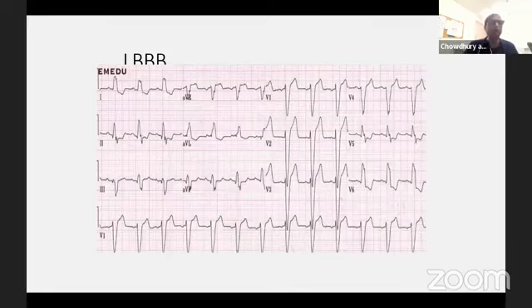Left bundle and paced rhythm, I'm not going to talk too much about it, because a new left bundle, but clinical context is important. Somebody coming with toe pain or belly pain below the umbilicus and an EKG is done, then this is not MI. Clinical context is important.